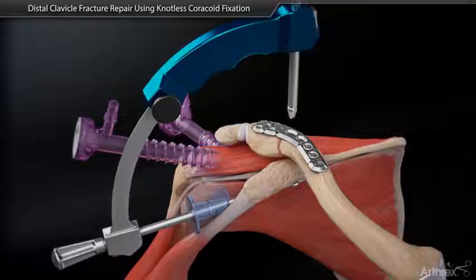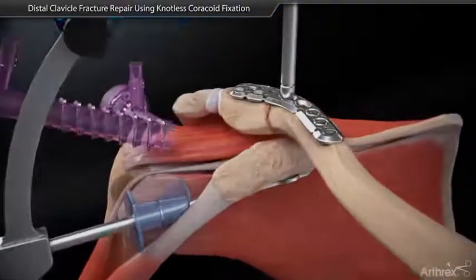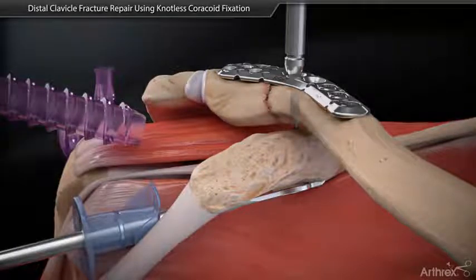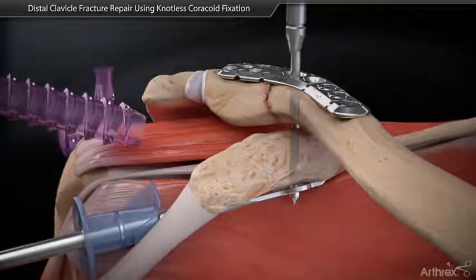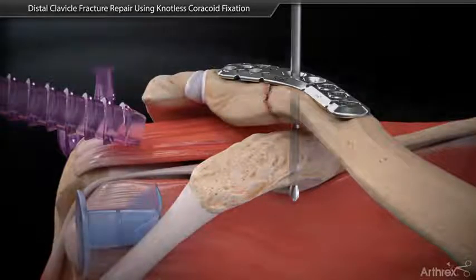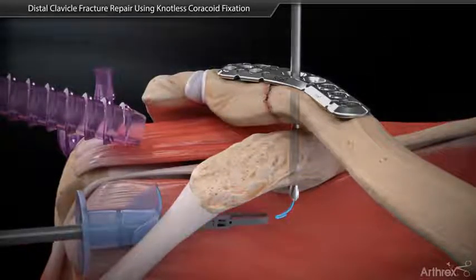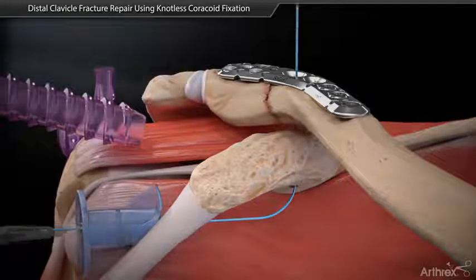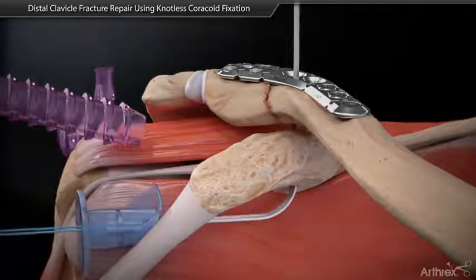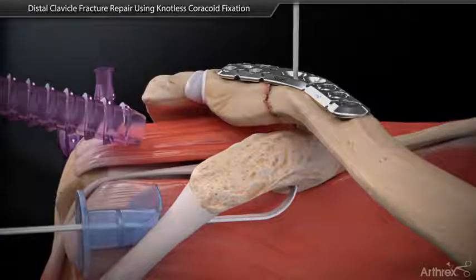Place the drill sleeve in the plate slot and drill a 3mm tunnel through the clavicle and coracoid. Remove the guide and retrieve a fiber stick through the drill.